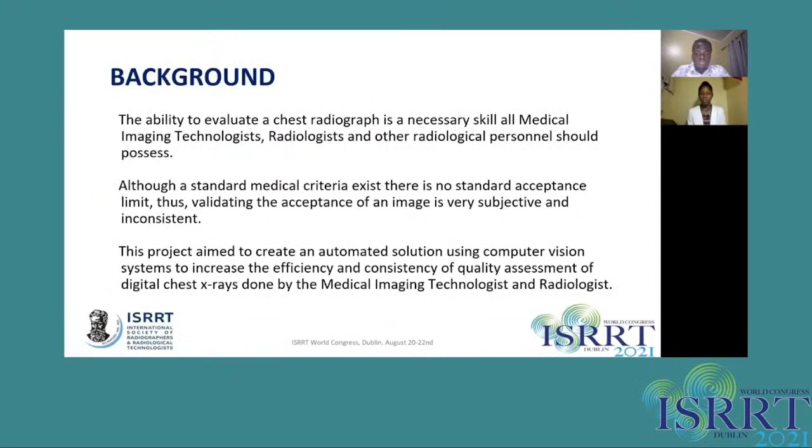I'll start with giving you a little bit of background. The ability to assess a chest radiograph is a mandatory skill for medical imaging technologists as well as radiologists. Although a standard medical criteria does exist for evaluating these images, there is no standard evaluation limit. Thus, validating the acceptance of an image is very subjective and inconsistent. This is a prominent issue at health institutions within Guyana. This project aims to create an automated solution to counteract these issues.